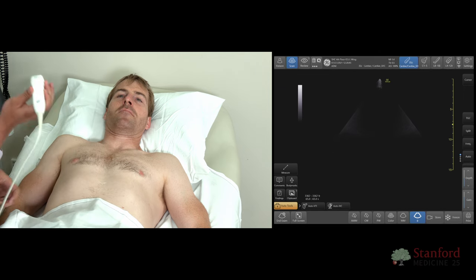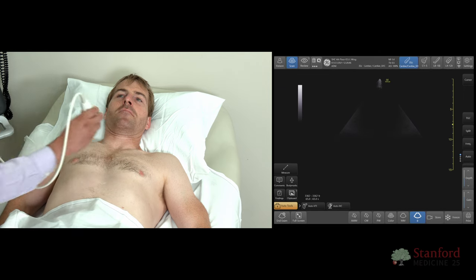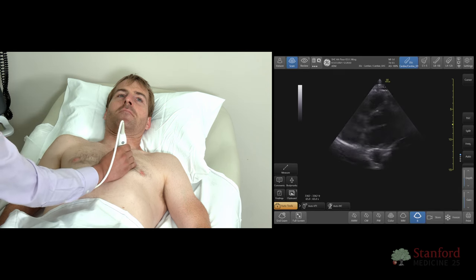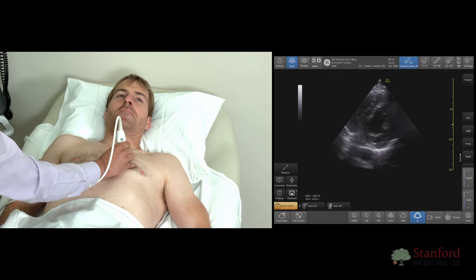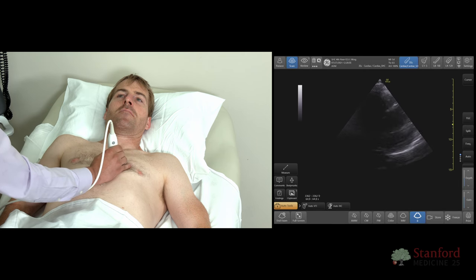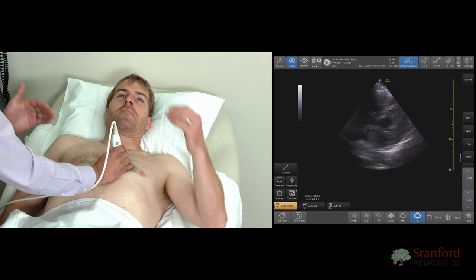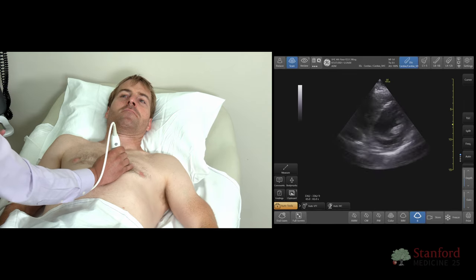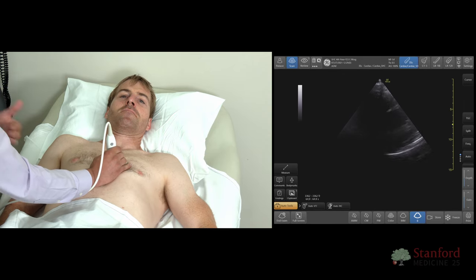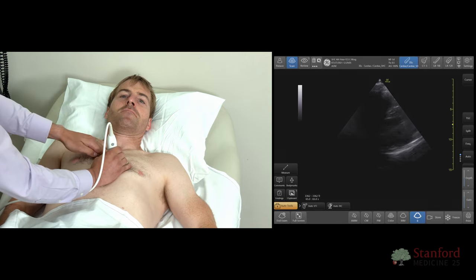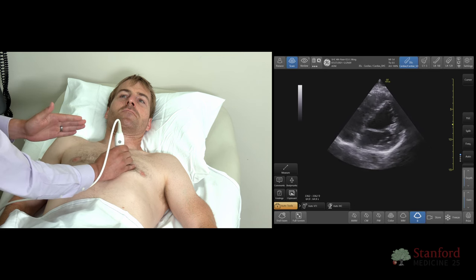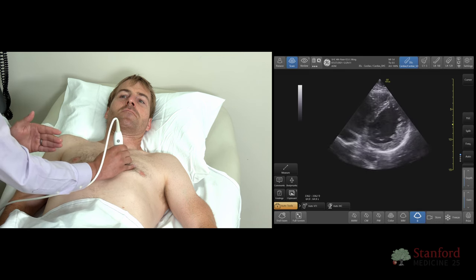Thinking about the images for a parasternal short and troubleshooting it: we now have the dot pointing towards the patient's left shoulder. With the parasternal short, a couple of things can happen. First, be sure that you're not over the sternum. As you're rotating, there's a tendency to actually move the probe. As we see here, if you're seeing a lot of black, that just means you're over the sternum. Just slide the probe slightly laterally, and you'll be able to see.